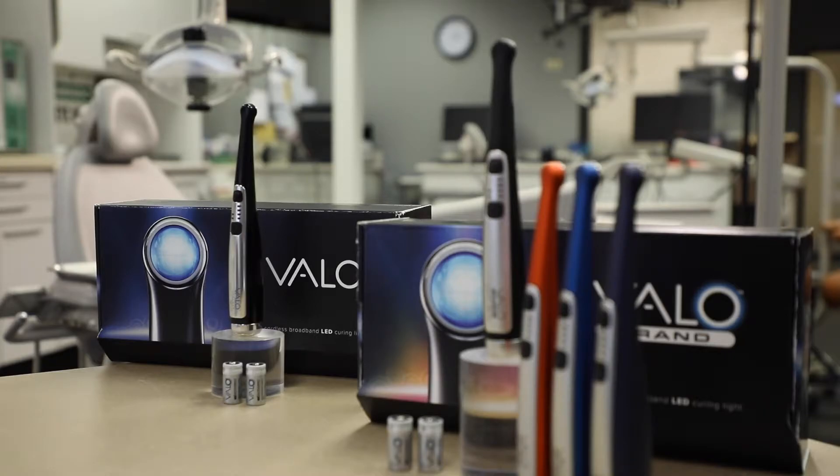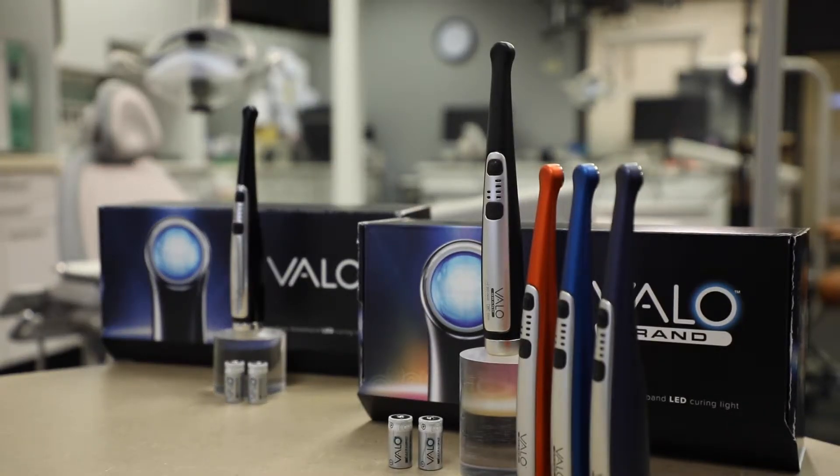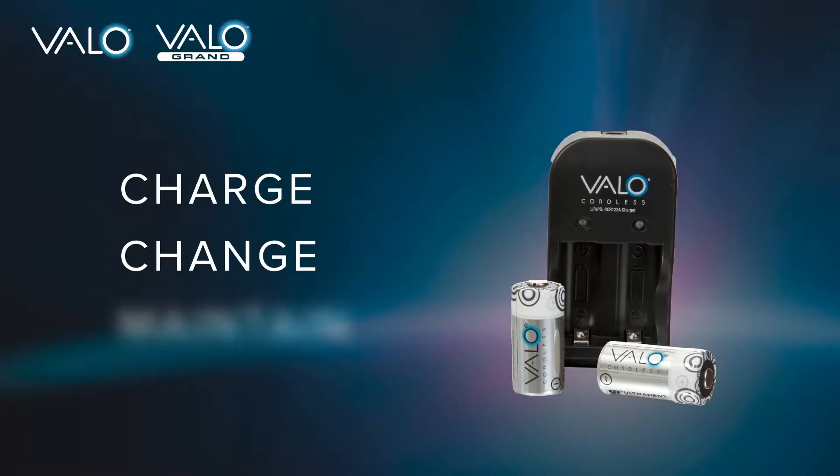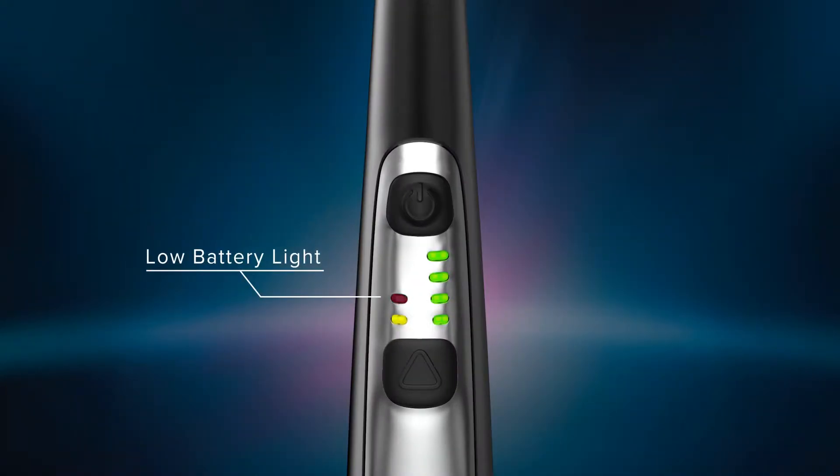The VALO and VALO Grand curing light comes with four rechargeable lithium iron phosphate batteries. This video will show you how to charge, change, and maintain your batteries and charger to ensure safe usage. The curing light signals the user that it is time to change the batteries when the low battery indicator light is flashing red.